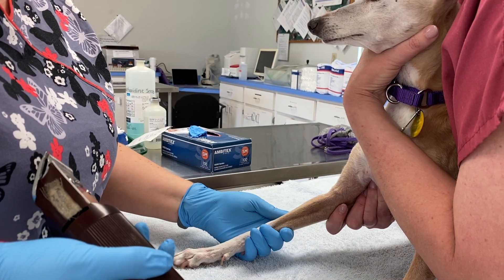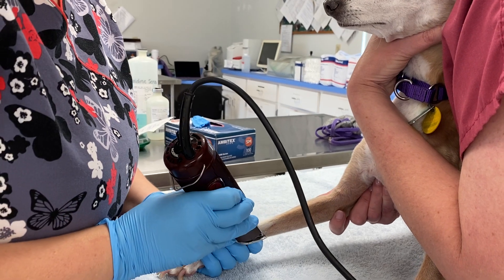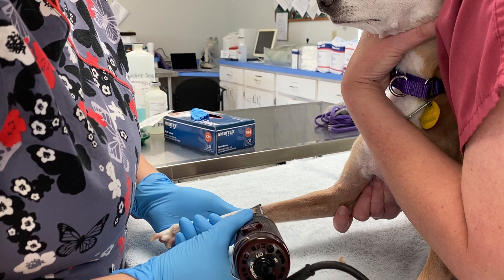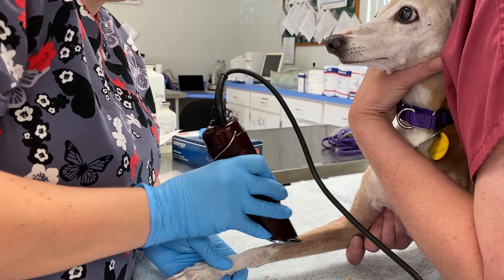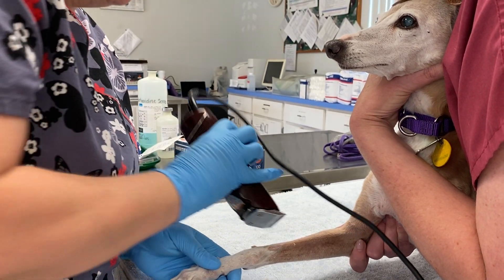The first step to putting an IV catheter in is you're going to need to shave your patient's leg. I usually start with where the vein is located, because if they're going to decide to scream and run away from you, you may only have one shot to turn on your clippers. If you have the ideal situation, you want to shave all the way around their leg.